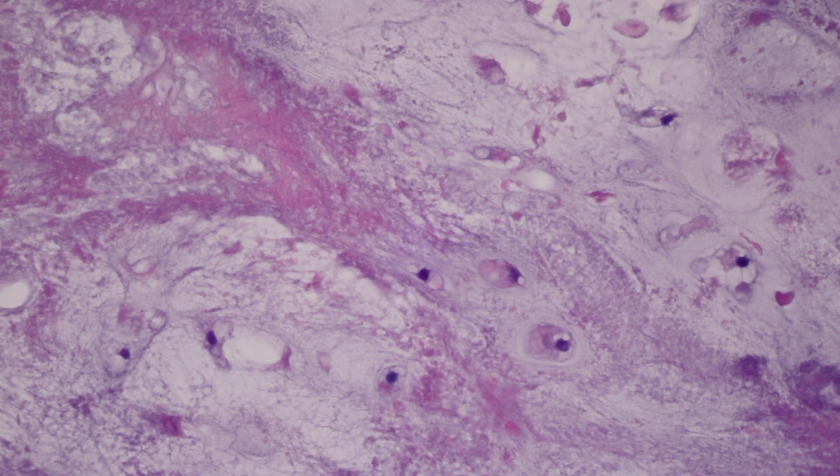And one other feature that I assess is the nature of the cartilage matrix. Most benign cartilage tumors are composed of hyaline cartilage. In many chondrosarcomas, the cartilage becomes myxoid. And what is the morphologic definition of myxoid cartilage? How do you distinguish myxoid cartilage from hyaline cartilage? By definition, in hyaline cartilage, the chondrocytes are residing in lacunar spaces. You do not appreciate cytoplasmic processes.